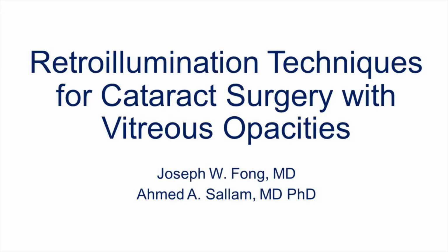Cataract surgery in the presence of vitreous opacities, such as in vitreous hemorrhage or endophthalmitis, is often combined with pars plana vitrectomy. Even so, the cataract surgery is often very challenging due to the absence of the red reflex. In this video, we demonstrate several retroillumination techniques using either a 25-gauge chandelier or a light pipe to optimize visualization during these difficult cataract cases.